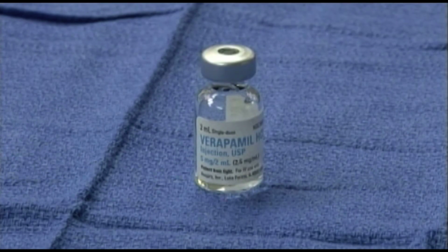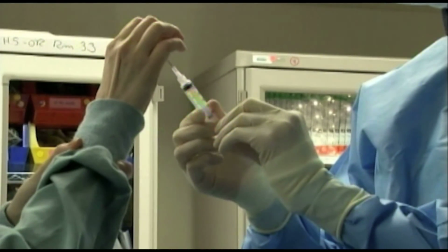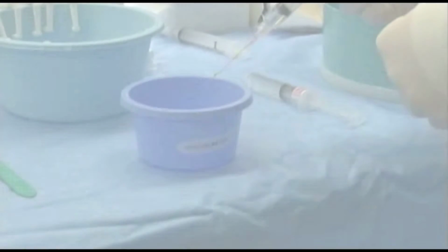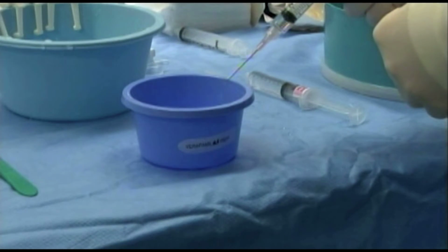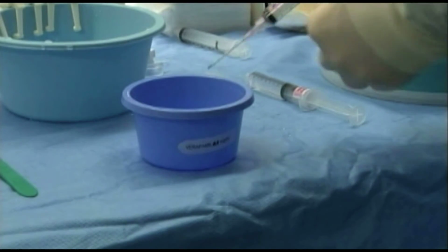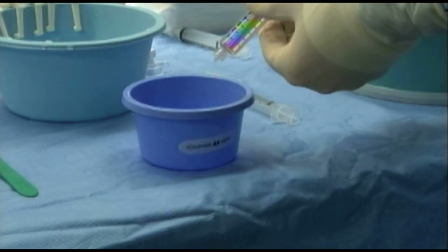Verapamil is an L-type calcium channel blocker. We use verapamil since the drug has a well-known safety profile established in the cardiac literature for the treatment of coronary vasospasm. The verapamil is diluted in heparinized saline to a concentration of 0.5 mg per cc. Our typical dose of verapamil per vascular territory is 20 mg, with a range on the order of 10 mg to 40 mg.